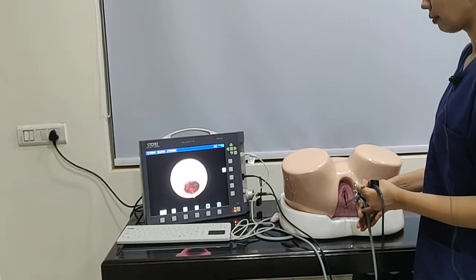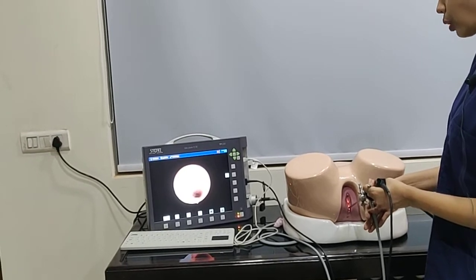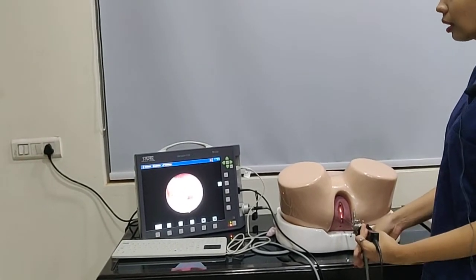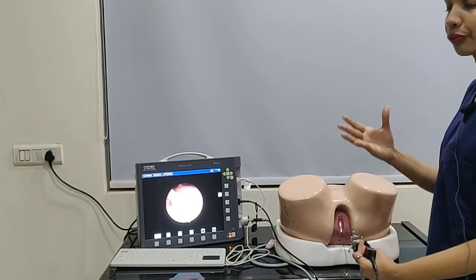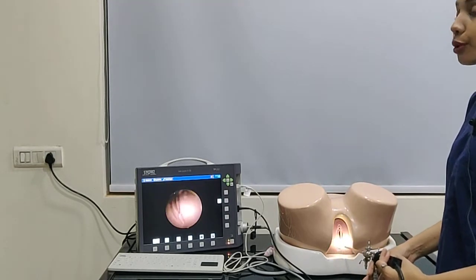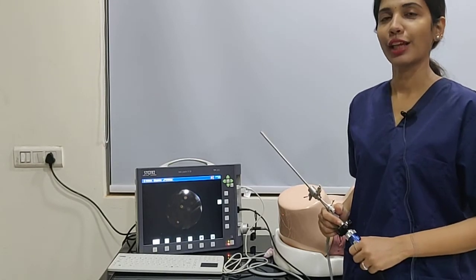While we are turning back, we may again see the cervical canal. Sometimes, also with these scopes, we can visualize the squamo-columnar junction, and we can also perform colposcopy because it can give a beautiful magnification. We can also inspect the walls of the vagina and then come back. The procedure will hardly take two minutes and the patient will not complain of any pain. Thank you so much.